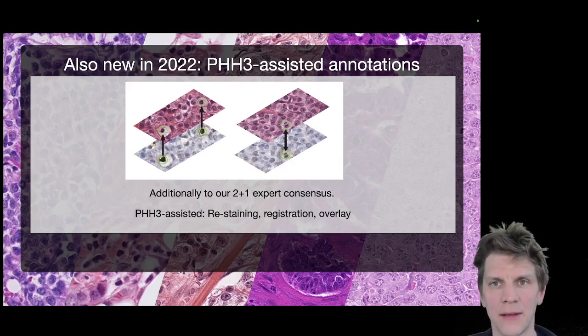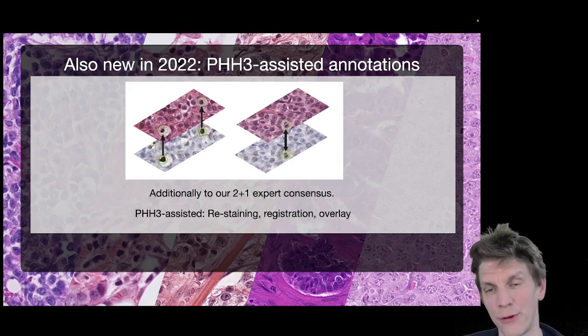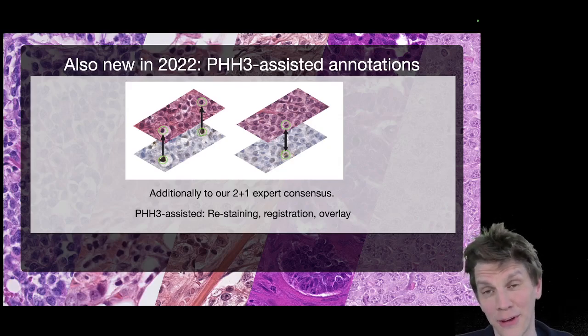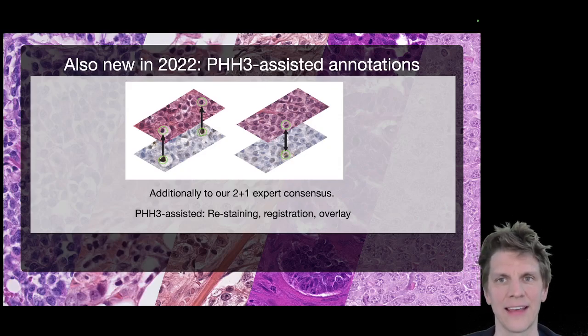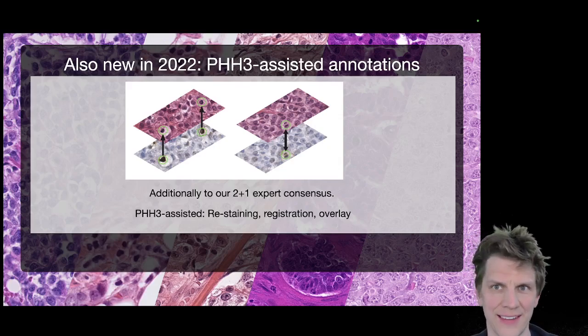We even had a machine learning model augmenting this to find potentially missed candidates. Then we would hand those potentially missed candidates over to the first pathologist, and then we would hand everything without knowledge of the labels to a secondary pathologist, and in case of a tie, we would hand it to a third pathologist. So that was our usual and well-established way of creating those mitosis datasets.